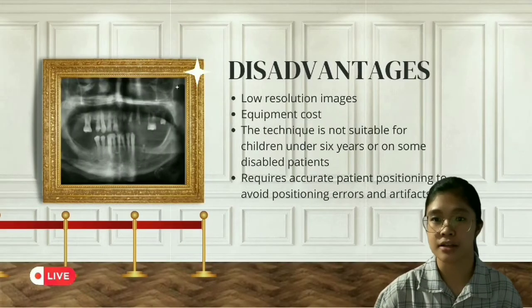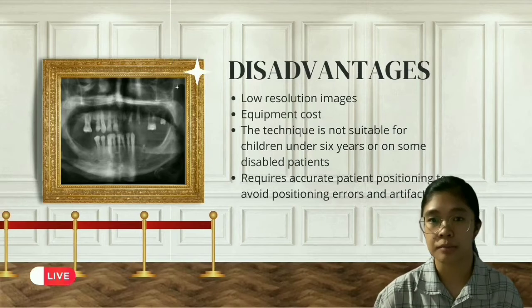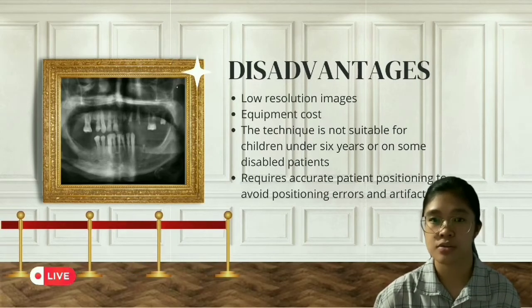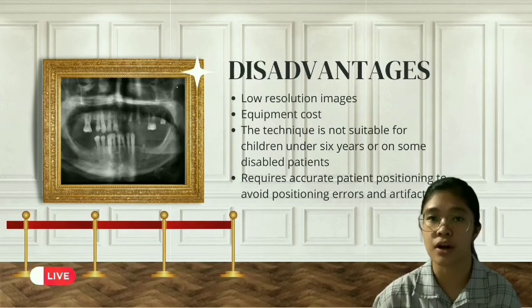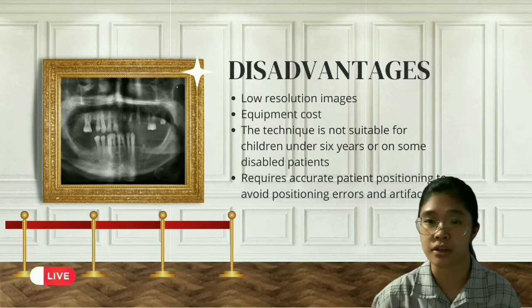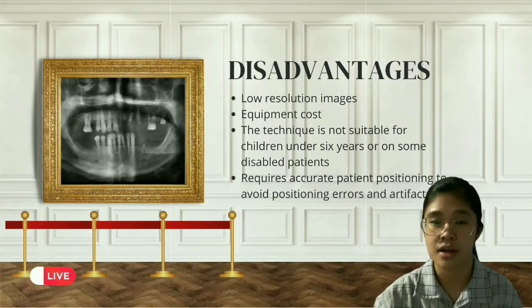And lastly, the disadvantages of panoramic radiography. Number one, it has low resolution images, so soft tissues and air shadows can overlay the required hard tissue structures that need to be interpreted, and it doesn't display fine anatomic details.